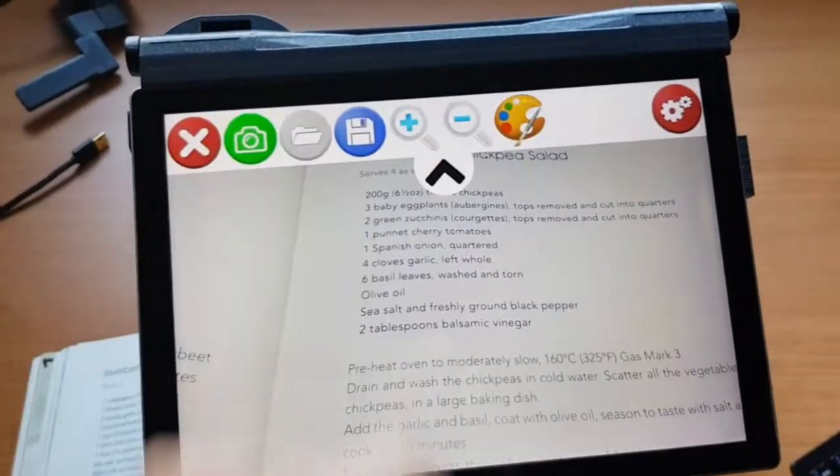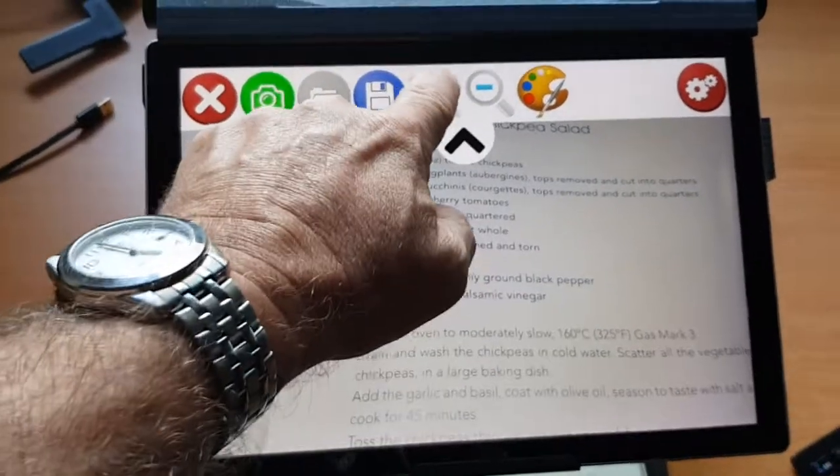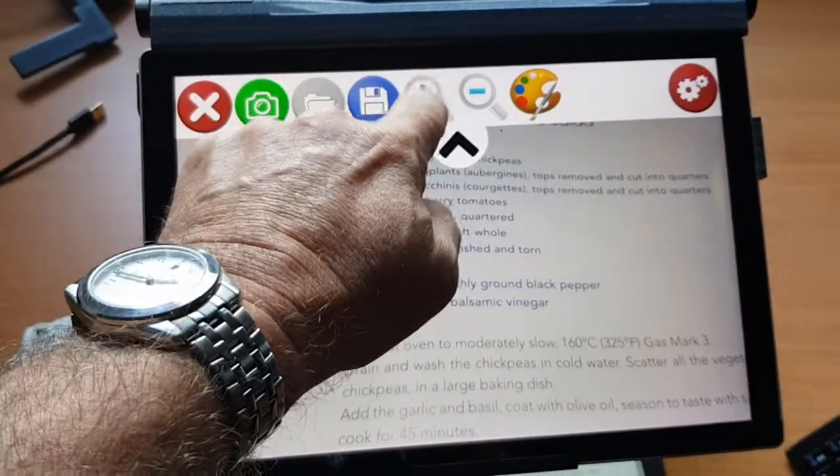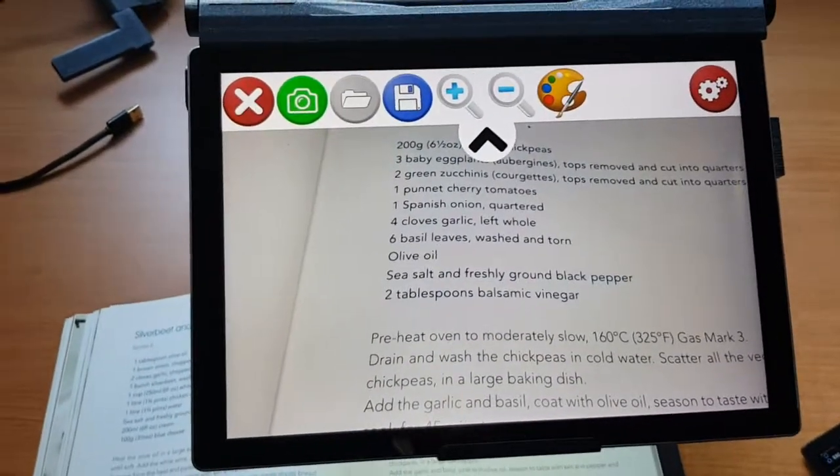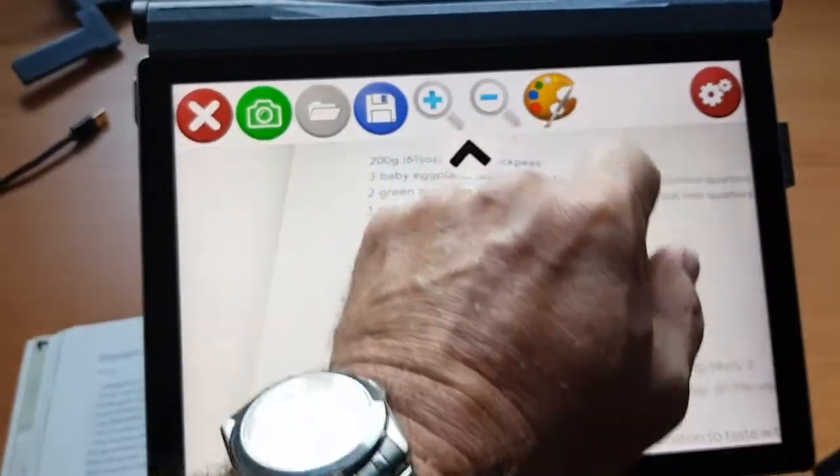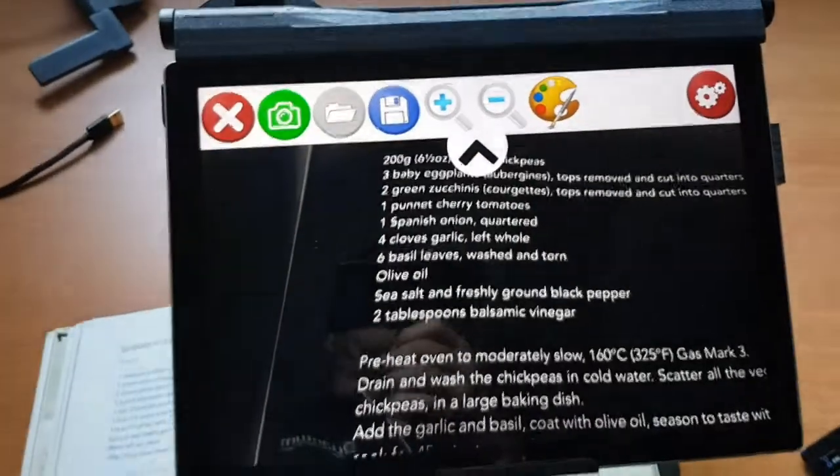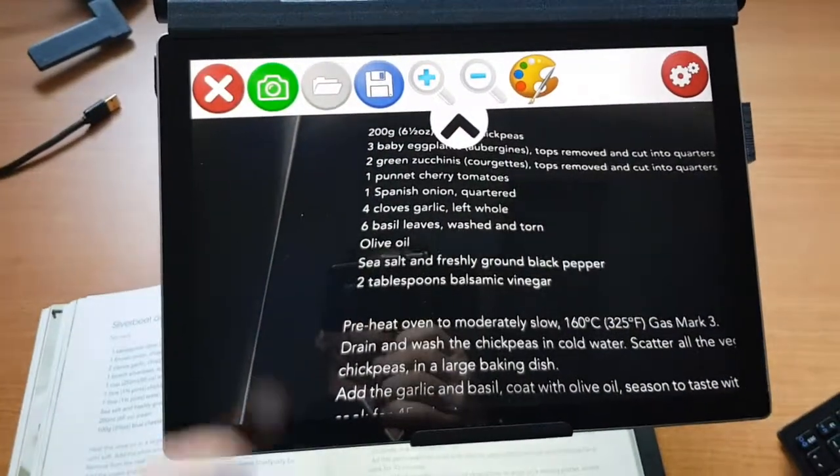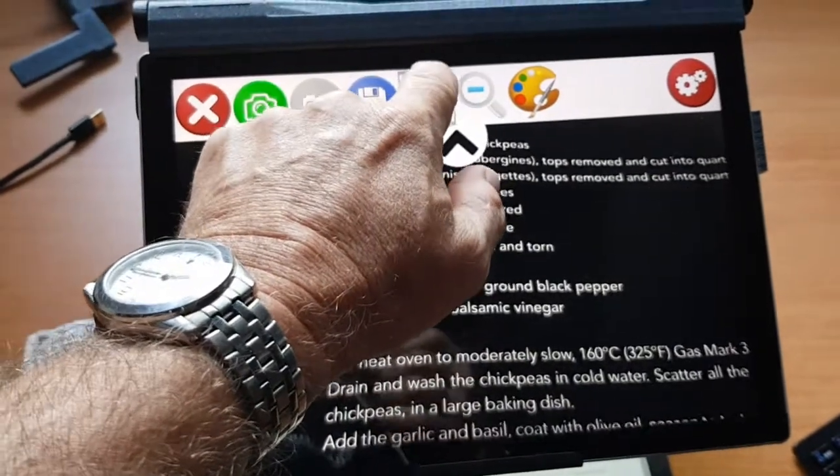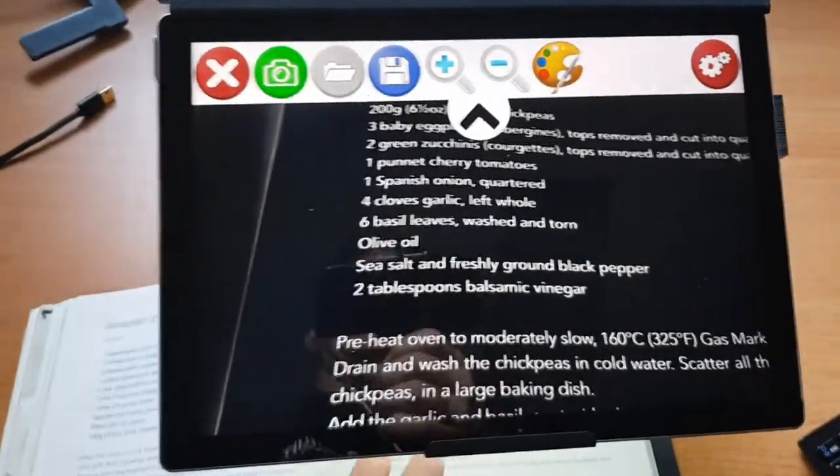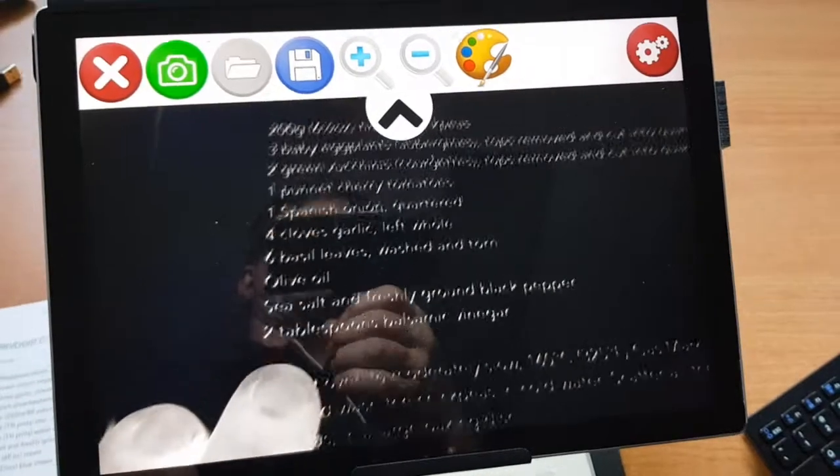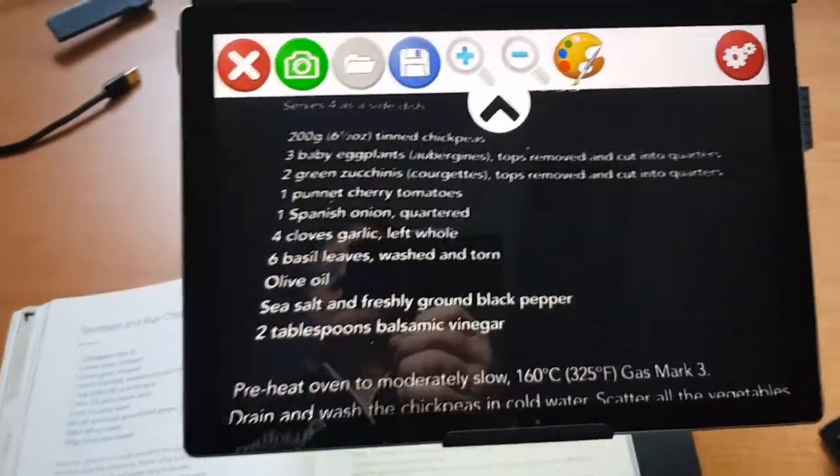As a magnifier, if I go to the menu here, we can of course magnify just with this control here. We can change the color of the background to allow for people with glare issues, and now of course we simply move left and right like this.